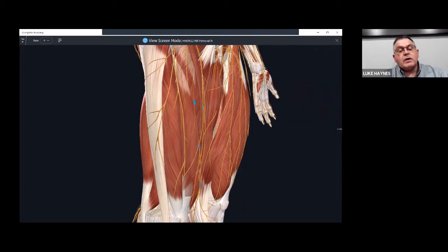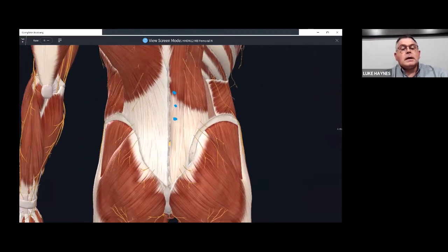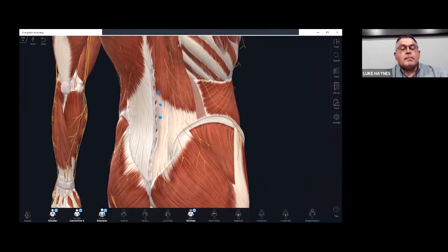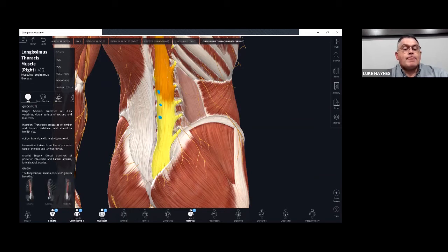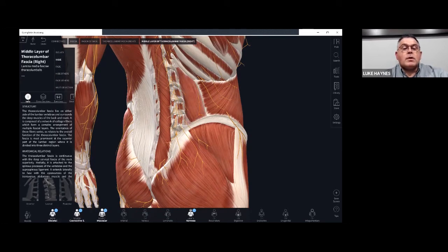I don't have it figured here, but we'll drop a needle into the vastus lateralis as well. And let's go ahead and look at L2, L3, L4. Now I'm going to take just a moment here, for fun's sake, I mentioned a patient from earlier today. I'm going to hide some things here so that we can take a look. We'll go deep. I want to demonstrate where the femoral nerve comes up.